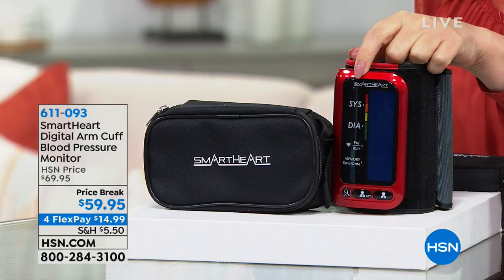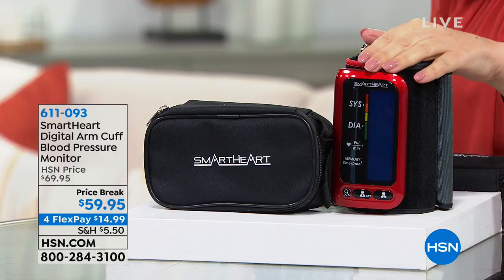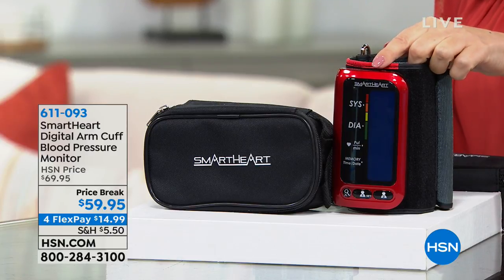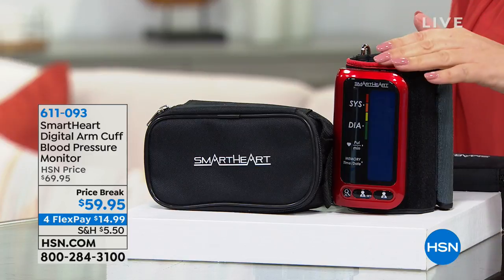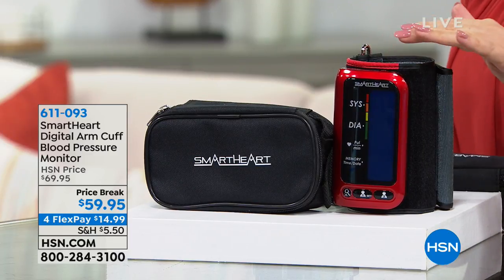Maybe you haven't been diagnosed with high blood pressure, but a lot of you haven't and don't even know it. This is the Smart Health Digital Arm Cuff Blood Pressure Monitor. We've got a price break of only $59.95, with FlexPay of $14.99. FlexPay uses the credit card you already have in your wallet — you put down a portion of the payment and we mail you the item right off the bat, and you pay it off over time.